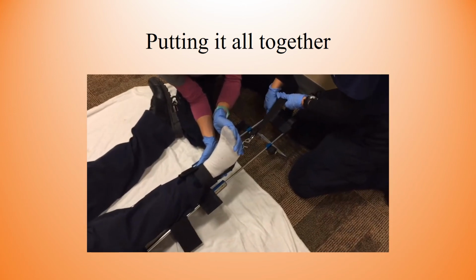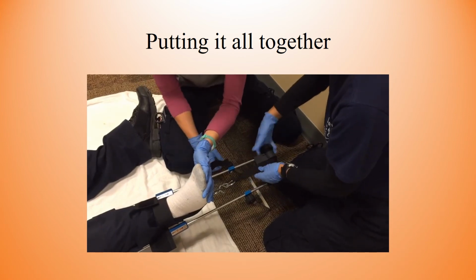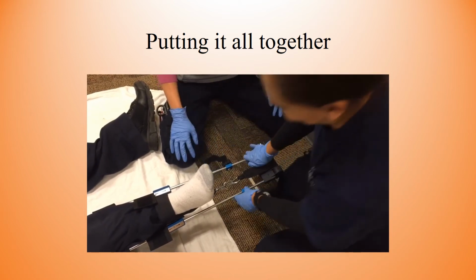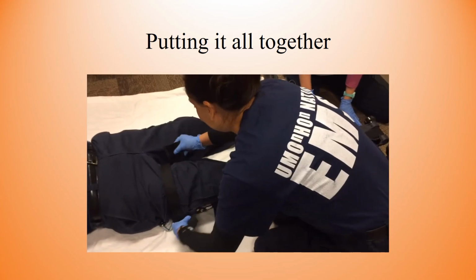We're going to pull mechanical traction out. Oh, there. Feel a little bit better? Yes, thank you.